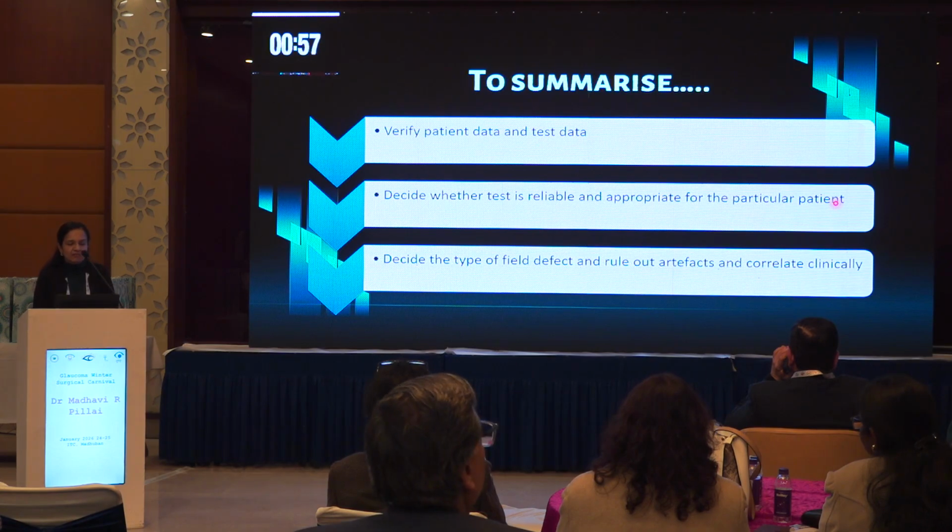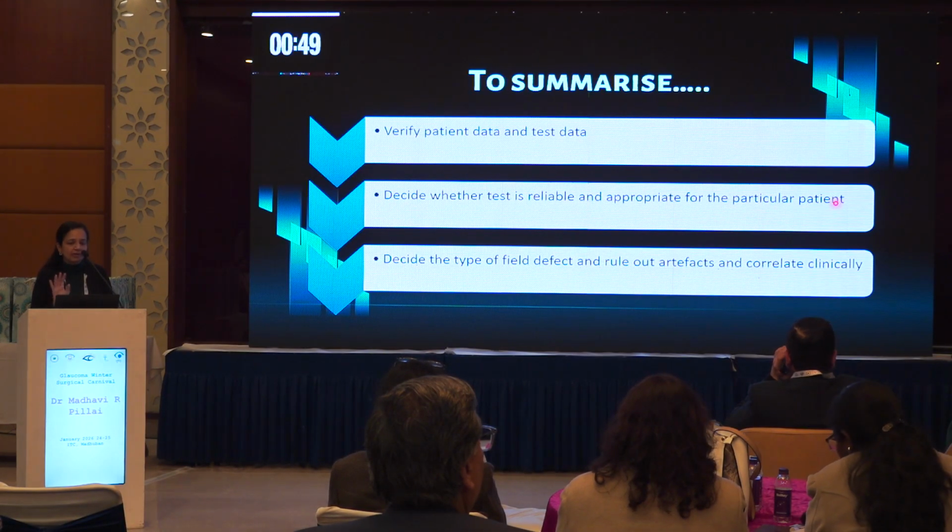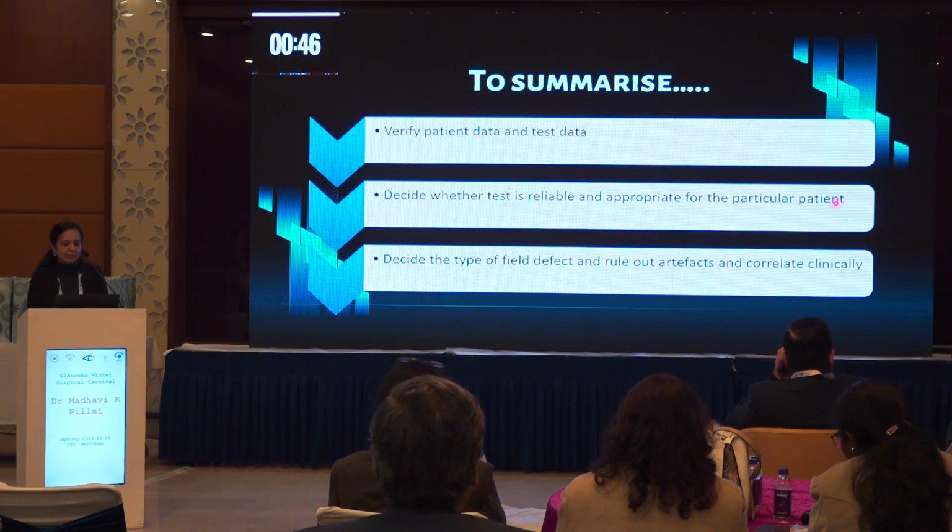To summarize, first verify the patient and test data. Decide whether this test is reliable and also appropriate for your particular patient, and decide the type of field defect. Keep in mind, rule out artifacts and correlate clinically.